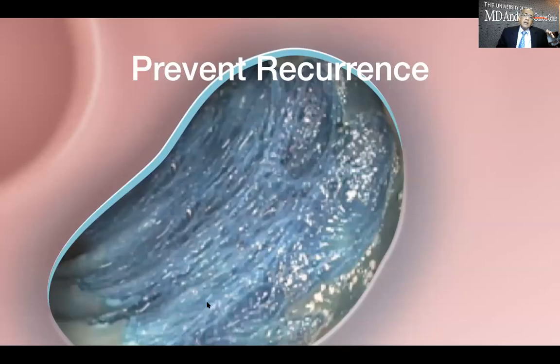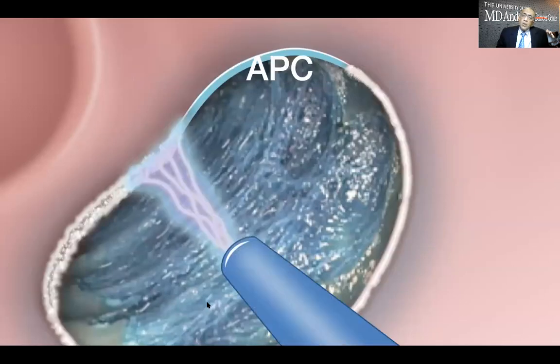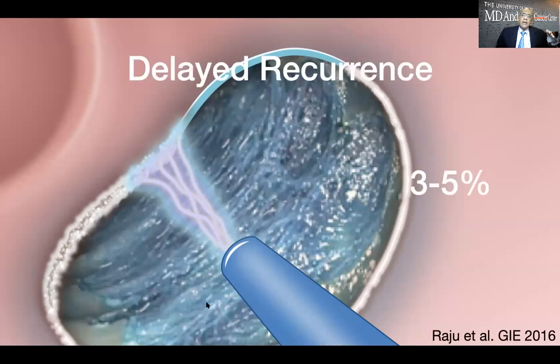You could consider argon plasma coagulation of the edge. I typically want to get a brown effect. I typically use 0.8 liters of flow, 30 to 35 watts. That's what I use, and a forced APC with a forward jet APC. With this, in my own practice, my delayed recurrence rate is pretty low, between 3 to 5% over the last 10 years, of probably more than 400 to 500 large polyp resections.